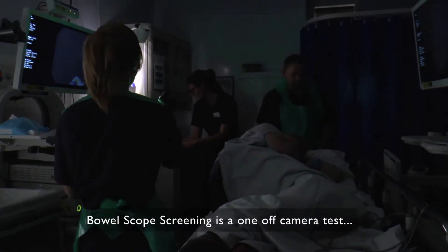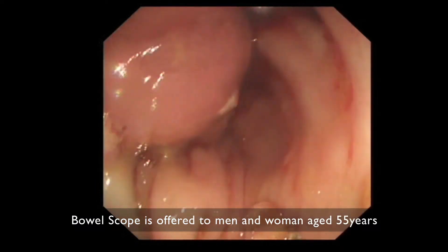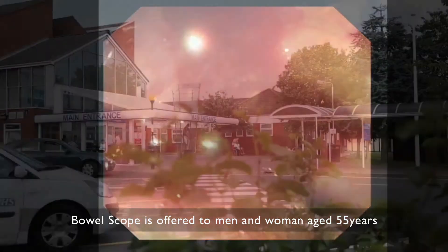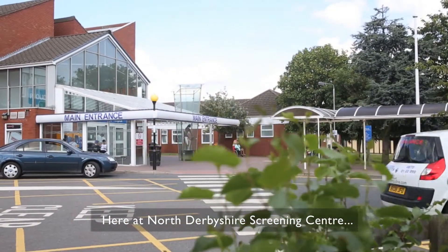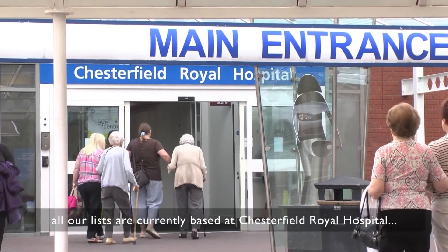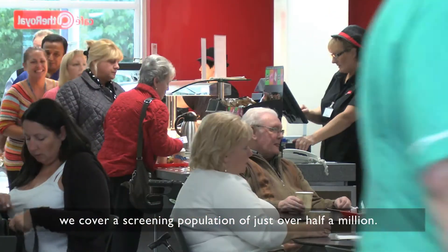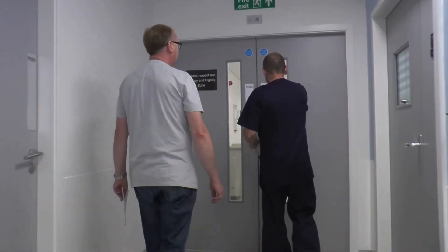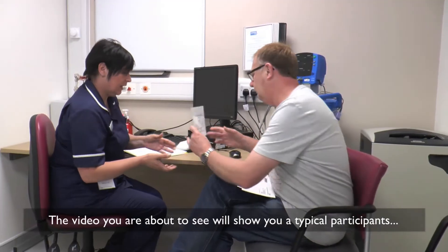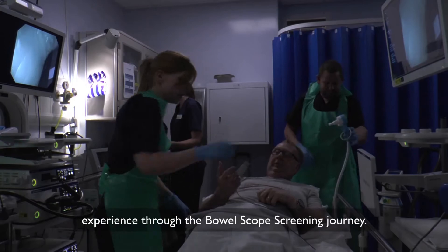Bowel Scope screening is a one-off camera test to help prevent bowel cancer. Bowel Scope is offered to men and women aged 55. Here at North Derbyshire screening centre, all our lists are currently based at Chesterfield Royal Hospital. We cover a screening population of just over half a million. The video you are about to see will show you a typical participant's experience through the Bowel Scope screening journey.